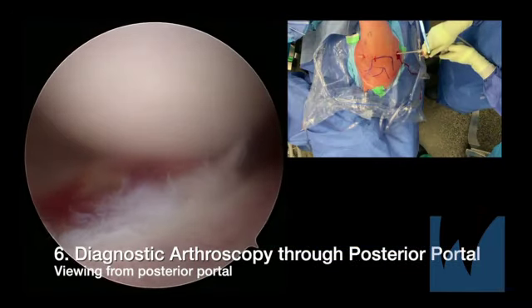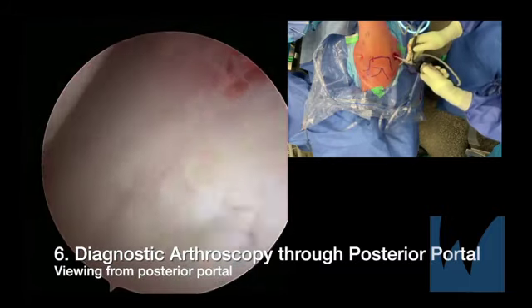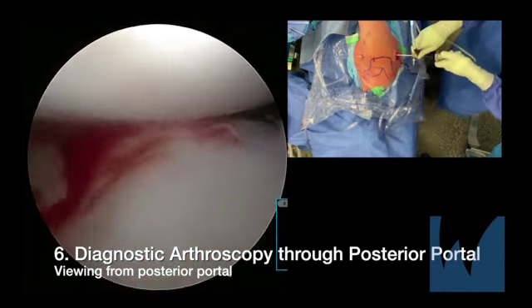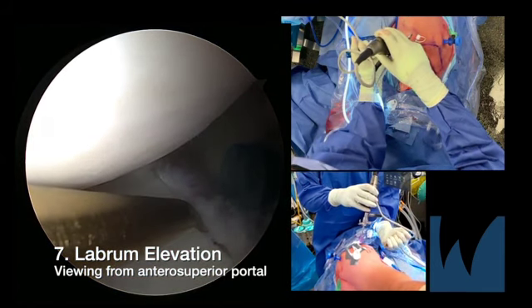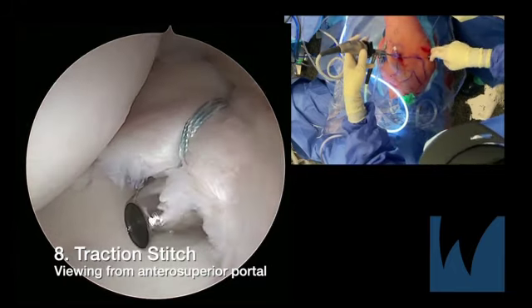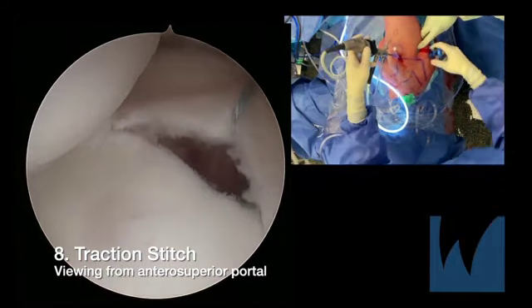Diagnostic arthroscopy is carried out through the posterior portal to evaluate the posterior and anterior labrum. In this patient, marked synovitis was noted as well as a significant posterior glenoid defect. Viewing through the anterior superior portal, the labrum was elevated from the glenoid to expose the glenoid defect. A traction stitch is used to retract the labrum to allow for viewing of the posterior glenoid with good exposure and to fully reveal the posterior glenoid defect.